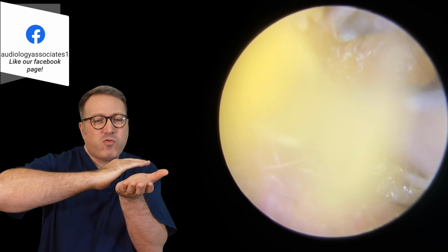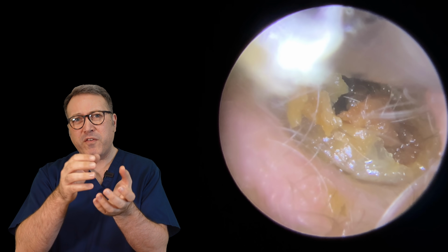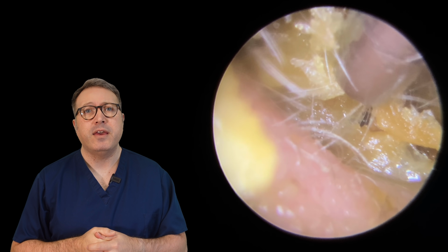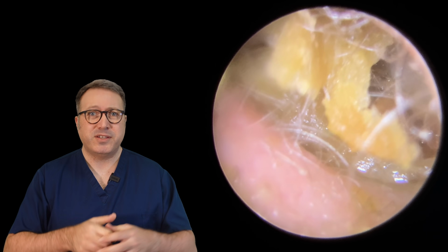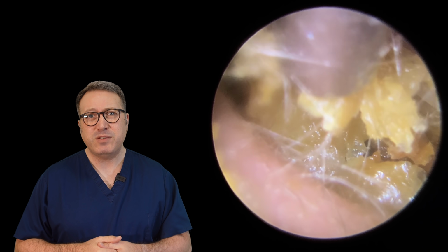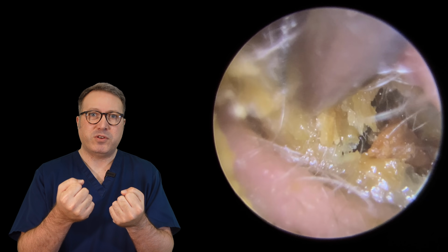Now, this skin is going right the way along the top of the canal wall, around the side and the bottom as well. So as we pull this out, what we're effectively doing is feeding this long strip of dry skin along the top of the wax there. There we are, we're just getting a good grip on the top here. You can see as we're trying to pull it forwards and down, trying to draw this skin along the top section. It is moving slightly, but suction doesn't always hold onto it tight enough for us to be able to pull this out, which is why we're switching tools again.